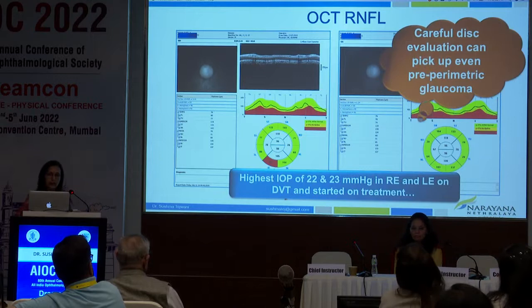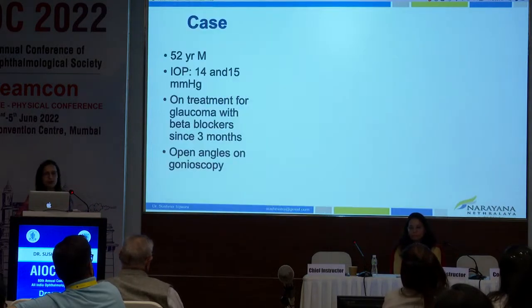And later on, when we did the blue on yellow field, it actually showed a defect in that part. I think that is missing here.